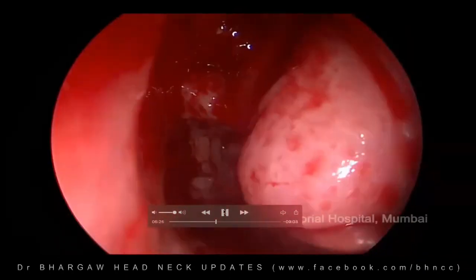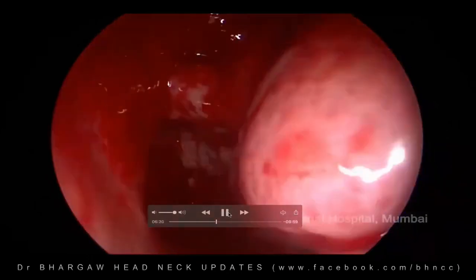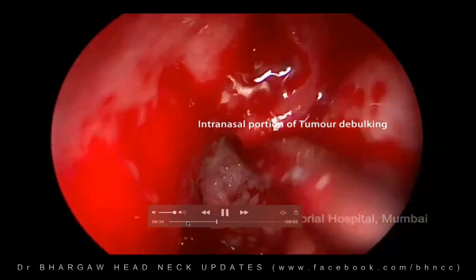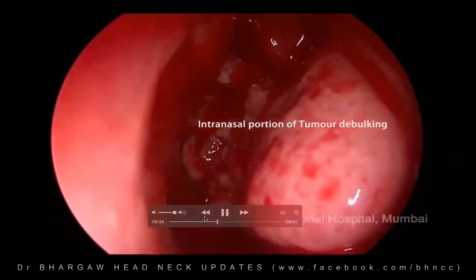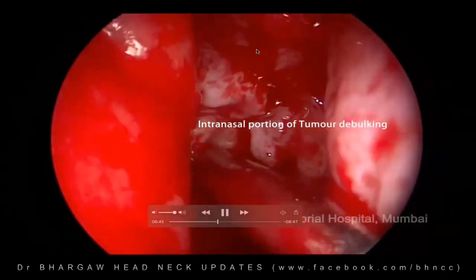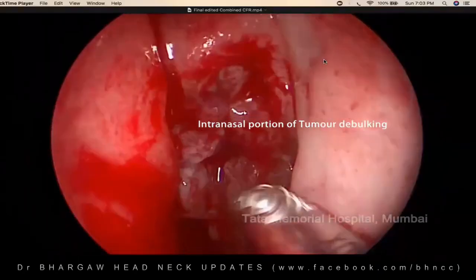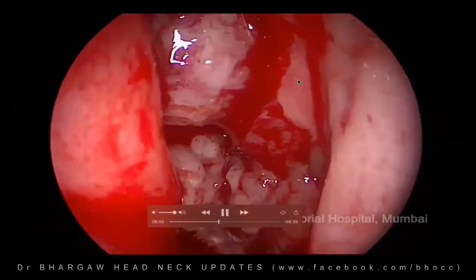So once that is done, then we are going intranasally. We stop there, and then we go and do the intranasal part. That is the tumor that is being debulked, without damaging the adjacent normal mucosa. You can see this septum is free anyways, but it's more so arising from the vault and the nasal wall on the left side. So we're just debulking the tumor here.